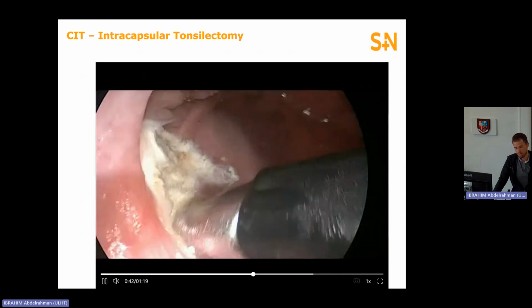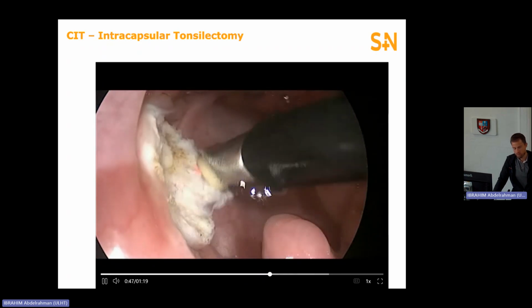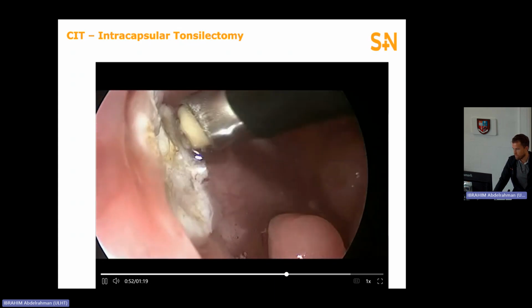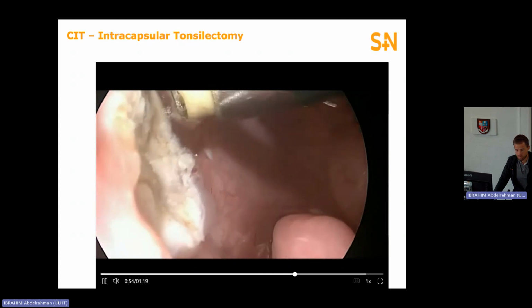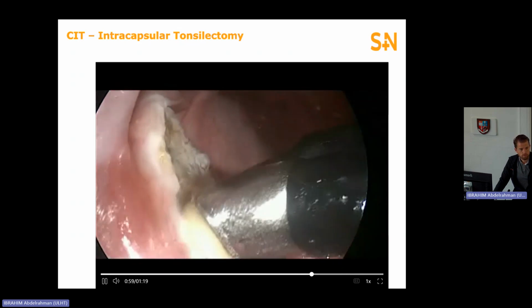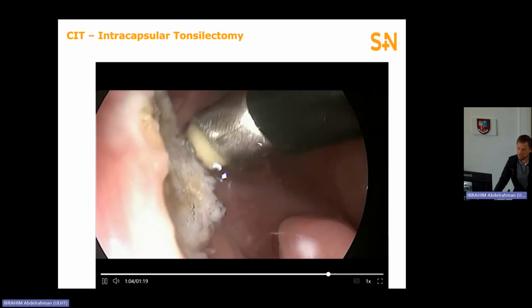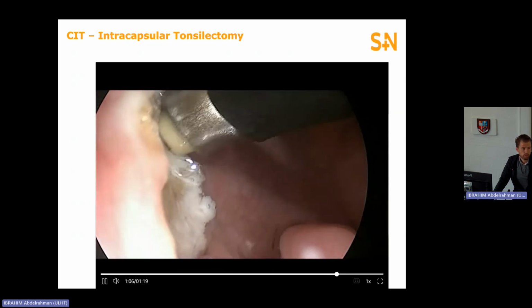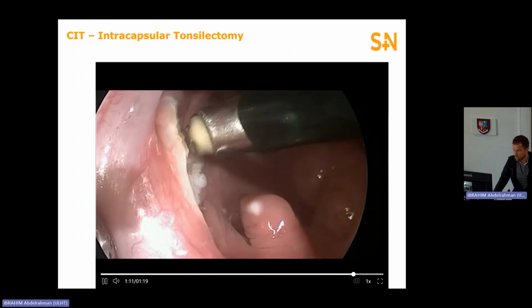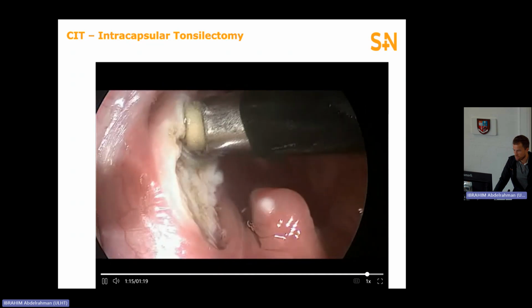But it's very much about listening, keeping your ear to the suction. If you feel it's compromising, take the wand out. We'll go through later what you need to do to unblock the wand if it does block. In your first dozen cases, you might have one or two blockages. After that, once your technique is good and you learn to manage the tip of the wand, you'll find that our high-volume users never block the wands, because they know how to use it effectively without blocking.